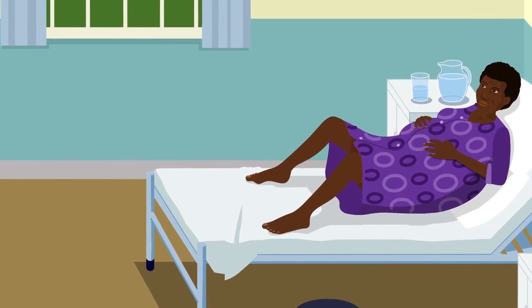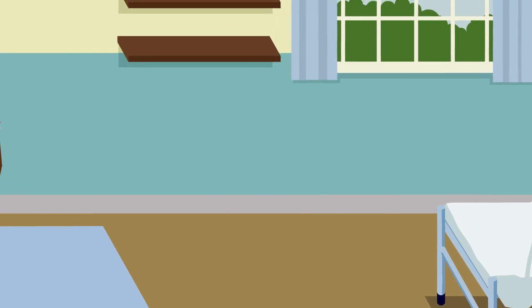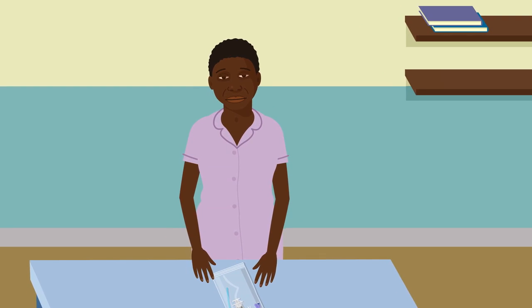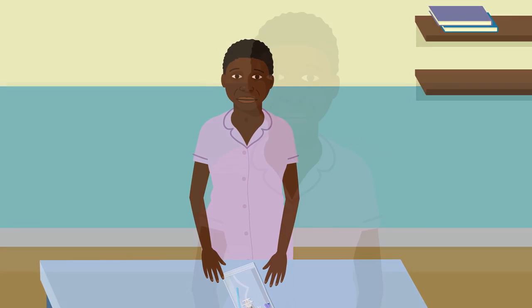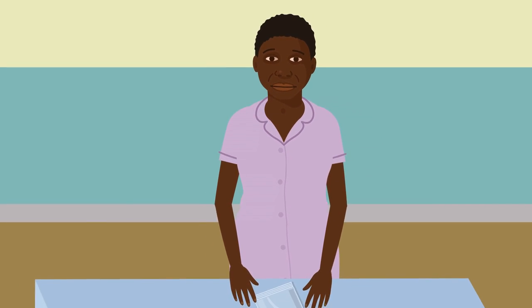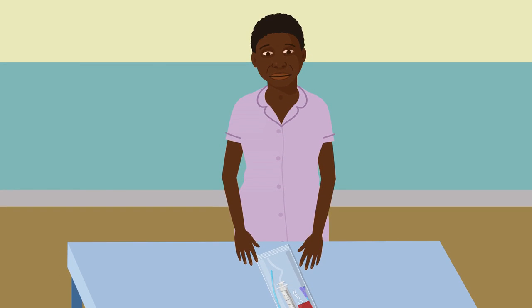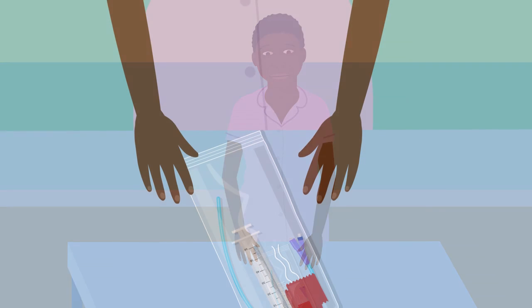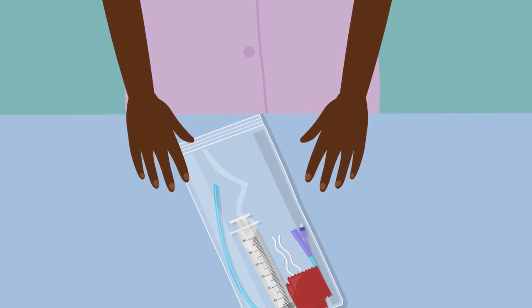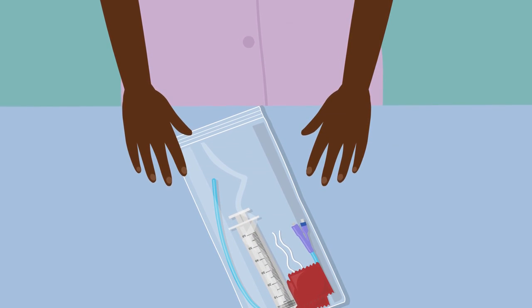Grace knows that some bleeding after a baby's born is normal. However, if a mother's uterus does not contract after the birth of the placenta, the bleeding can become severe. This is a life-threatening emergency called postpartum hemorrhage. Uterine balloon tamponade, or UBT, is a medical procedure which helps to stop severe bleeding and can save lives.